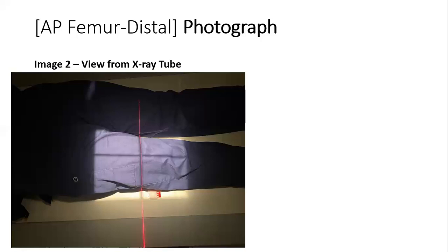Instructions for the patient for this exposure will be that we will need to tell our patient that they will need to hold still for us and not move while we expose for our image. If it is a pediatric patient, we will do our best to have them hold still for us before we take the image. We will watch them to take the image as needed. If need be, we will have other rad techs possibly hold the child to get the image needed.